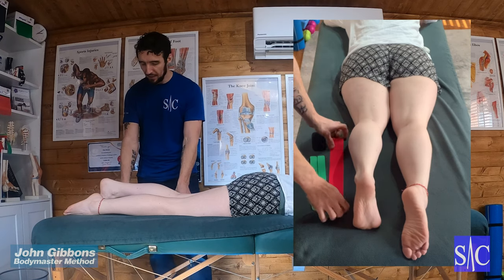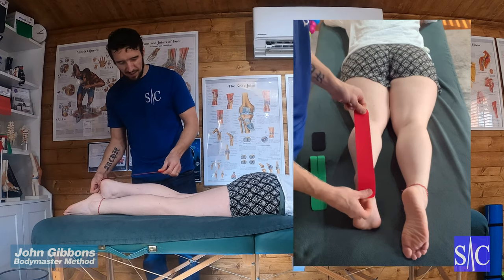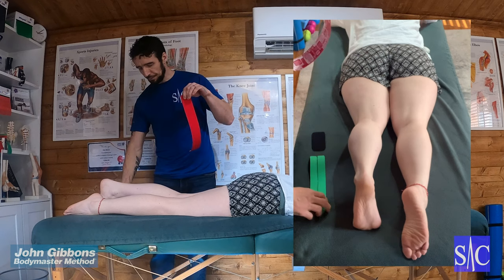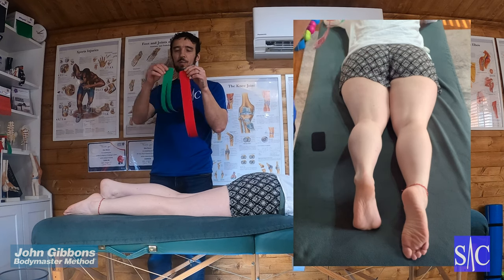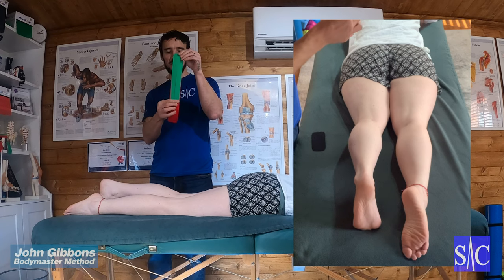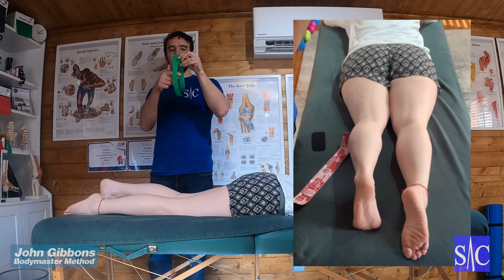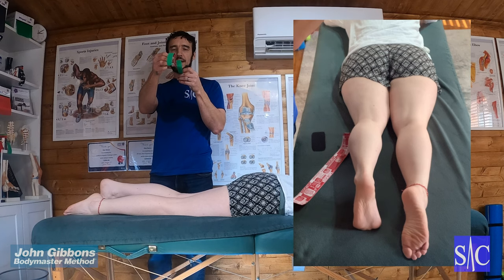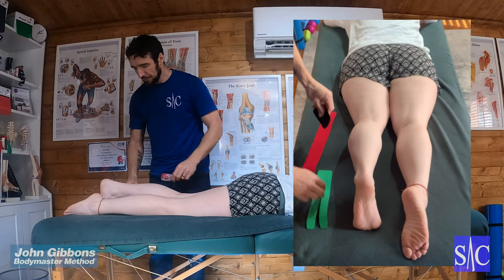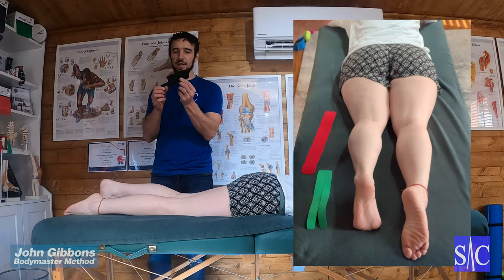We need three pieces of tape. The first piece: measure from under the heel to just below the knee. The second piece: measure about three quarters of the first, cut that off, and then cut it straight down the middle, leaving about an inch at the end. The third piece: measure ankle bone to ankle bone and then cut off.